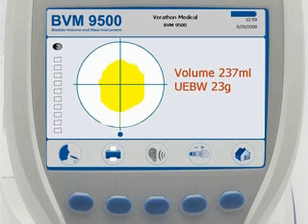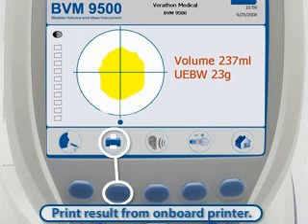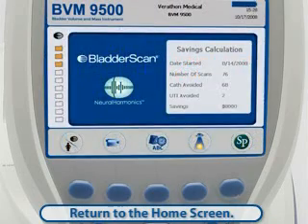After you have verified an accurate scan, you may select from the following options. Record a voice annotation to save your exam. Please note that if you do not voice annotate the current exam, the exam data will not be saved. Print the exam result from the onboard printer. Make a manual measurement of bladder wall thickness. For more information on this feature, please see the BVM9500 Quick Reference Card or User's Manual. Return to the home screen and perform another exam.